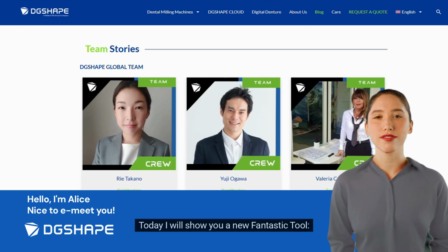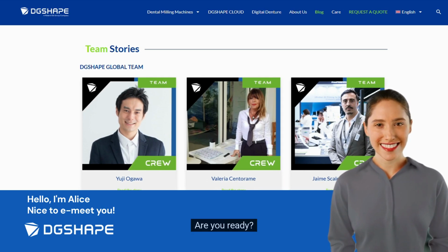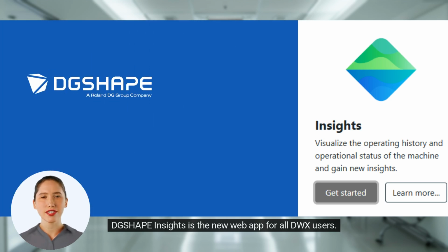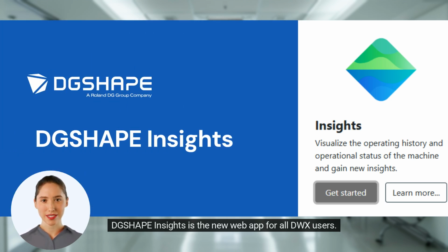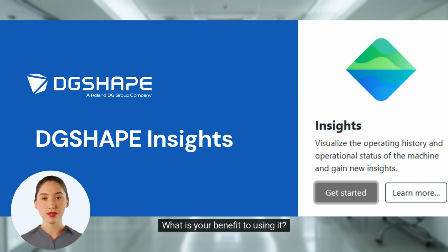Today I will show you a new fantastic tool, DGSHAPE Insights. Are you ready? I'm ready to surprise you. DGSHAPE Insights is the new web app for all DWX users. We developed this web app to empower your business. Its strength is the data and analysis that you can manage. What is your benefit to using it?